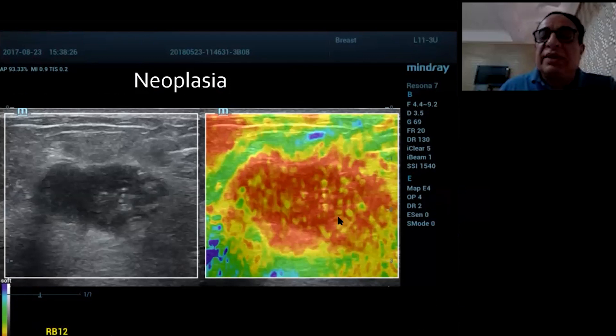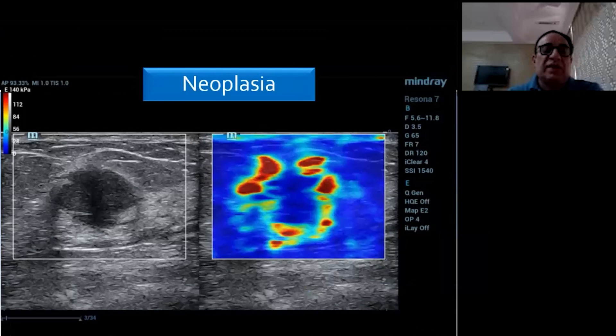Here a lesion which appears lobulated with some speckles of hyperechogenicity is much larger on the B-mode than on the elastography map. It is a color score four or five, suggesting neoplasia, with small areas of softness as you can see here.